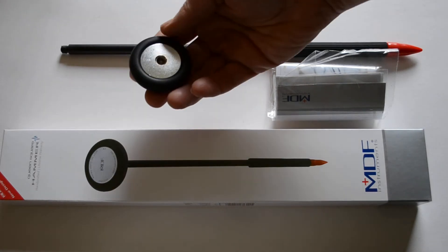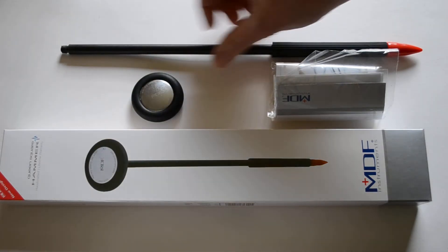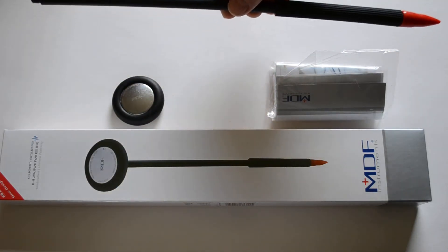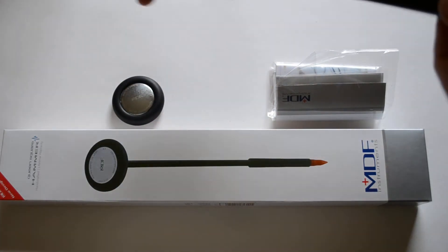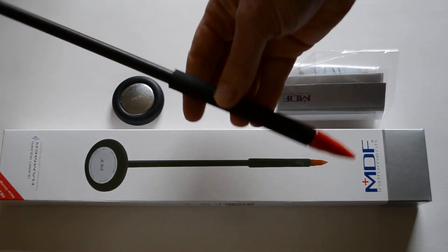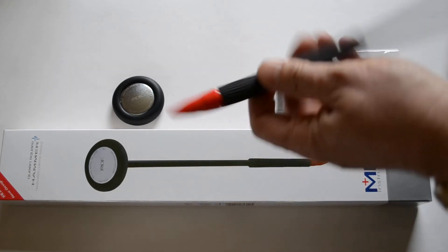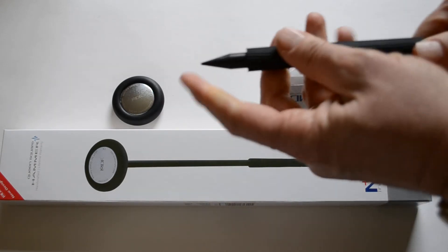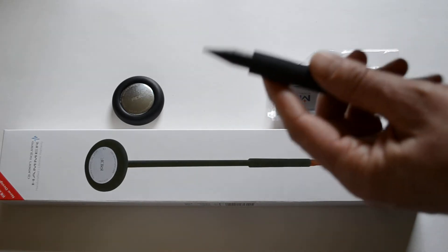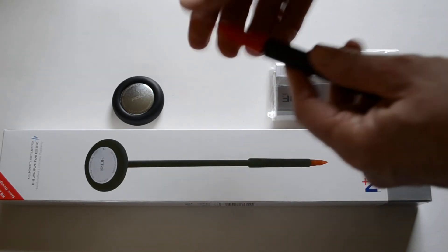Flat-packed reflex hammer with a square head — funny why it's called a Queen Square when you've basically got a round unit here, but it's square on, I suppose. The handle has an easy grip, thick portion to it, with a rubber tip protecting the soft points — not a particularly sharp point but perfectly adequate for neurological examination.